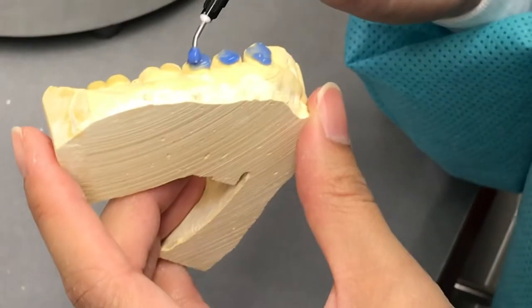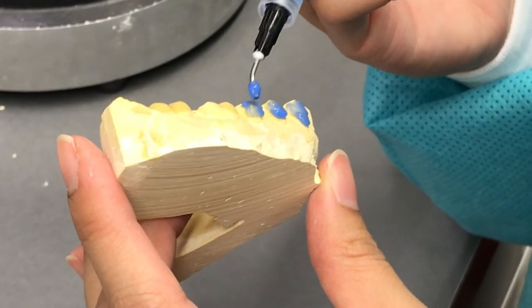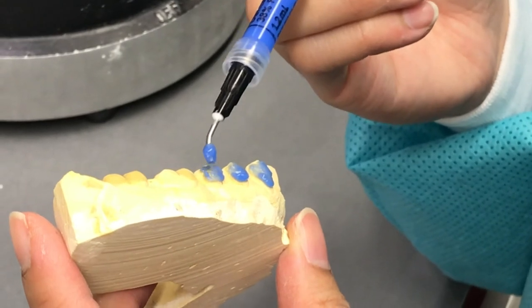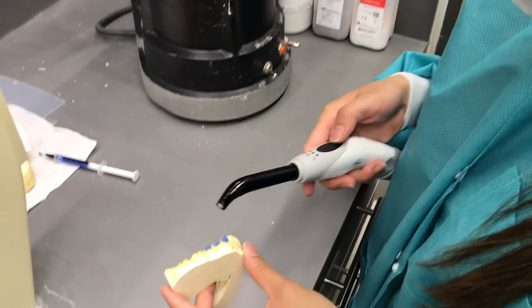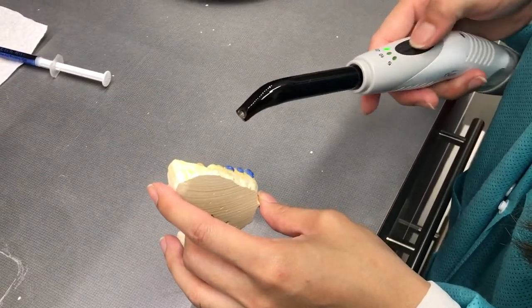So you put this material on top, so when you put the bleach material, it has a little space in between because we're going to make the bleach trays here, and then you're going to make it smooth. Then you light here, don't look at the light, so 20 seconds.